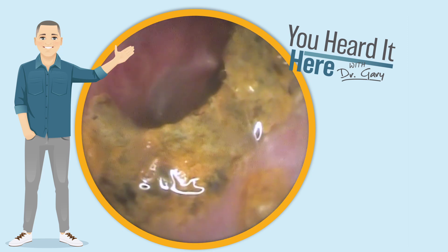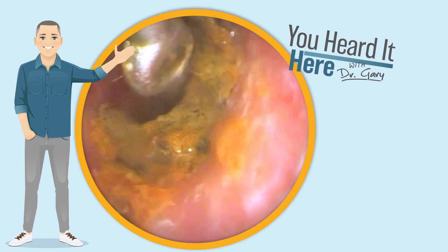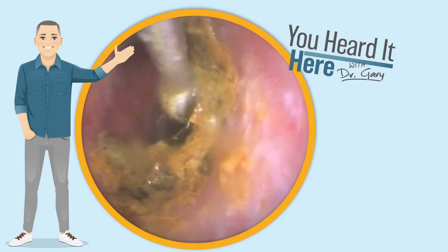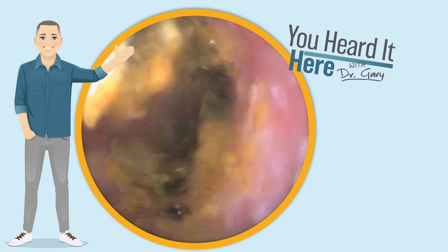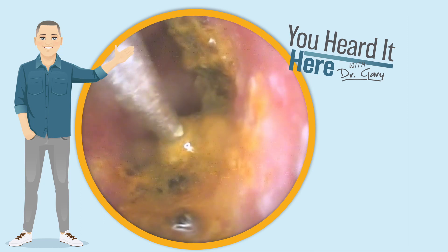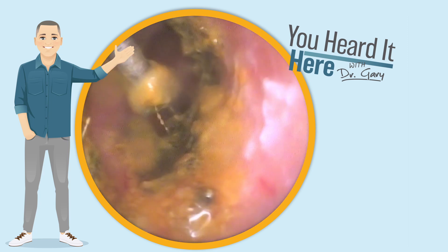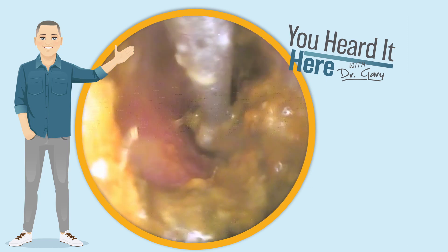Now we can definitely see part of the eardrum, and the wax is really stuck to the bottom and the right side of the ear canal. We're going to use the curette to remove the rest of this wax and get this patient on their way. At this point they are showing less hearing loss and not feeling any more of the aural fullness. The irrigation didn't hurt the patient — it does feel kind of weird having that much water flow into your ear.